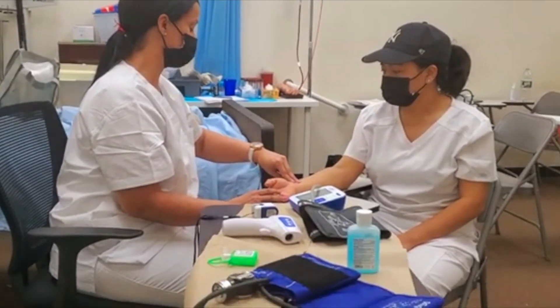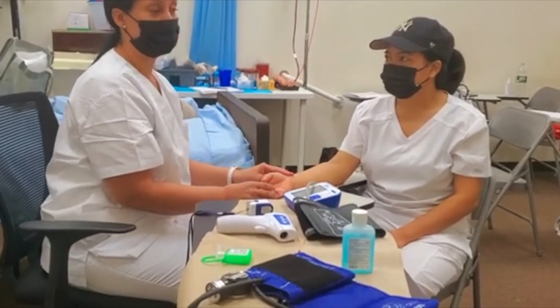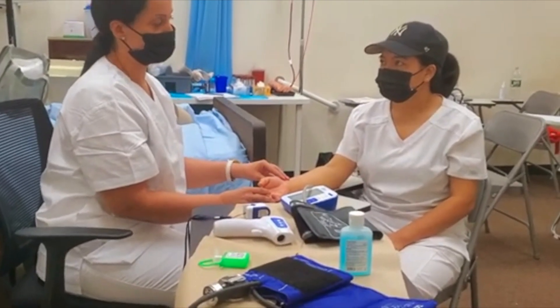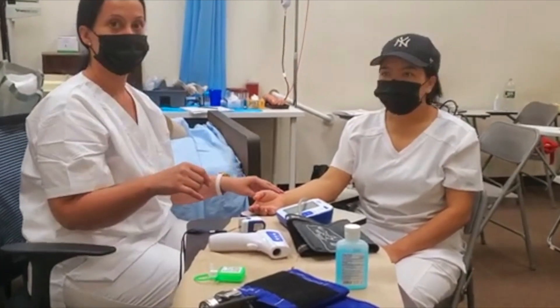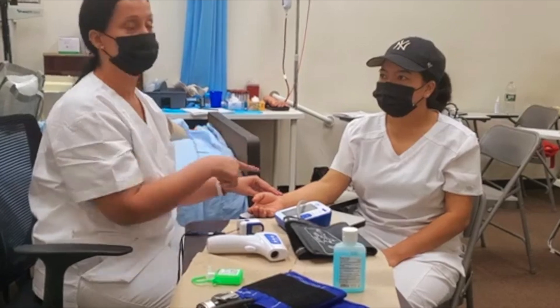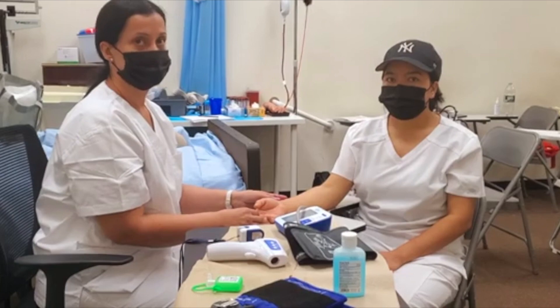Okay, so her pulse is 65 beats per minute. The normal range for an adult is between 60 and 100 for the pulse. She's 65, which is normal — it's within those parameters.